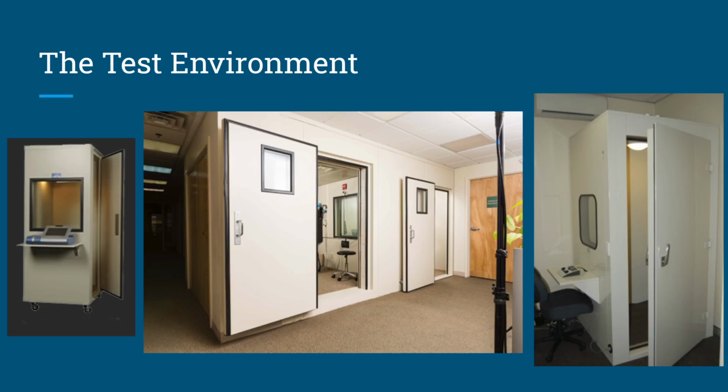With the advent of sound level meters built into modern computerized audiometers, boothless testing is becoming more common. Think mobile audiometry clinics, like for example, you can see this in some VA compensation and pension exam vendors. You can see this in nursing homes. You can see this where people are testing in patients' houses.